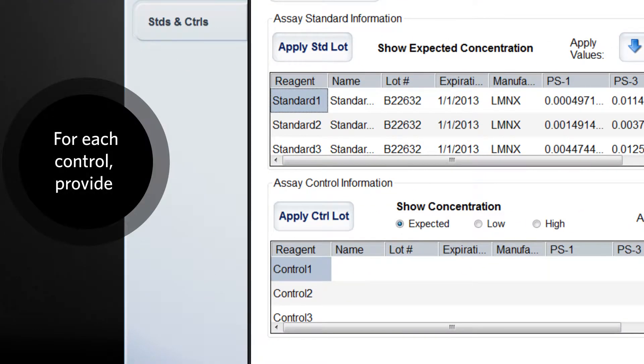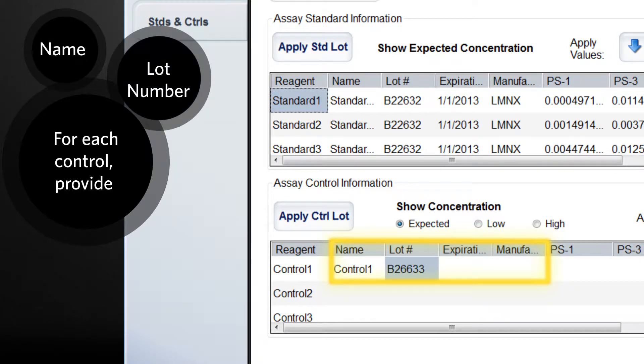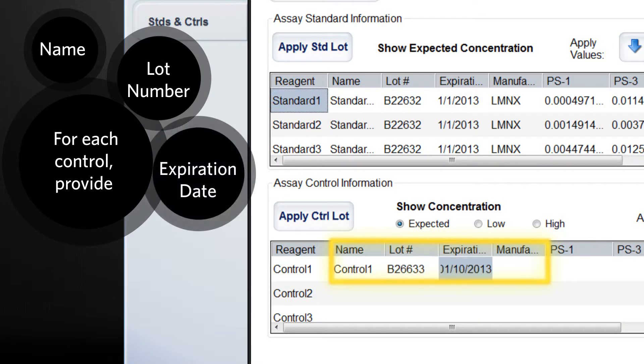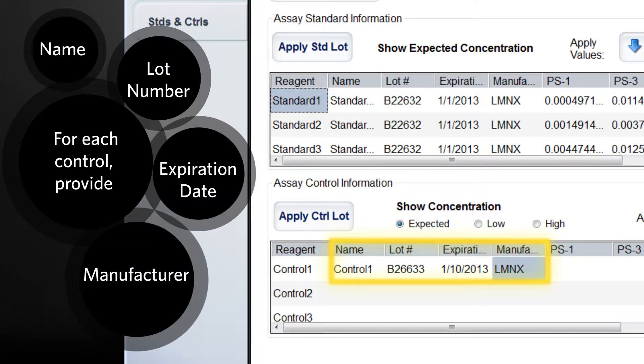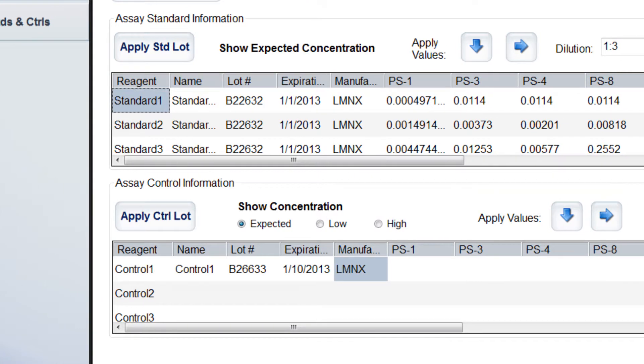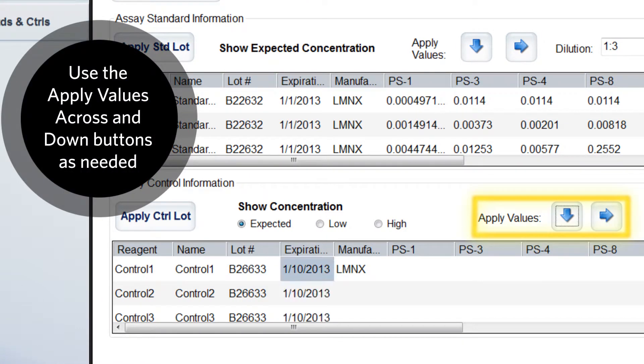Again, enter the name, lot number, expiration, and manufacturer for each control. You may use the apply across button and apply down button as needed.